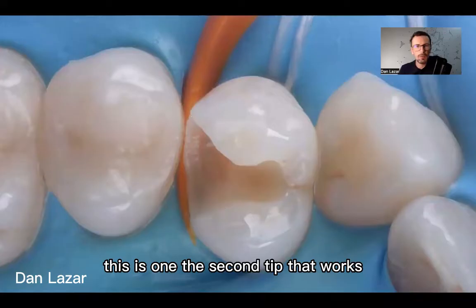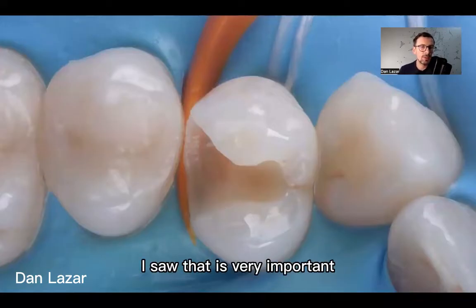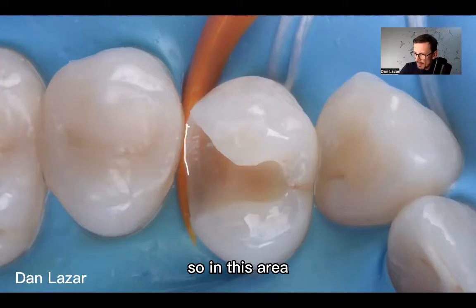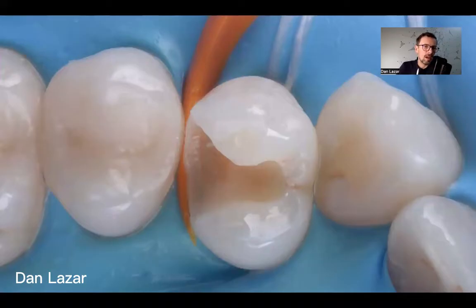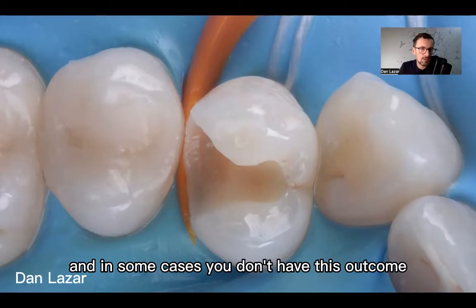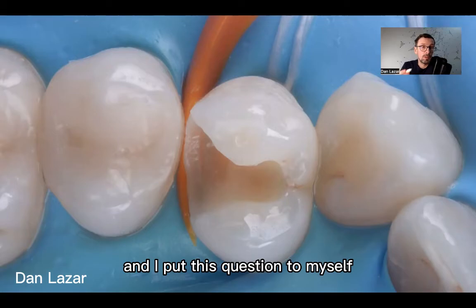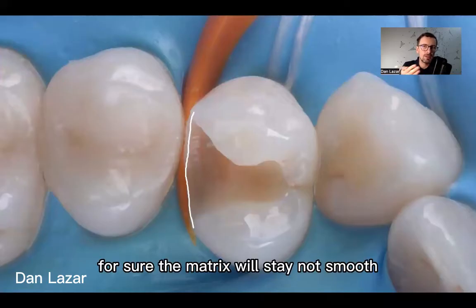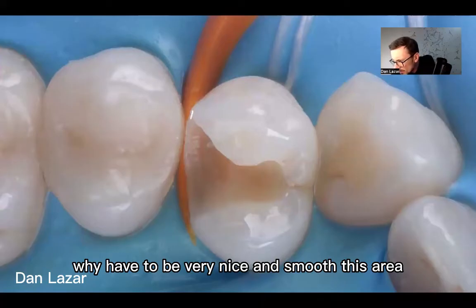The second tip that works and is important — I found it is very important — is how the matrix fits on the cervical area, in this area. The most important thing is how is the outline of this area? Probably you've seen in some cases that the matrix stays nicely there and you have a nice fit, and in some cases you don't have this outcome. I put this question to myself and I found it is very important: how is this line? Is it smooth or not? If it's not smooth, for sure the matrix will also not stay smooth.